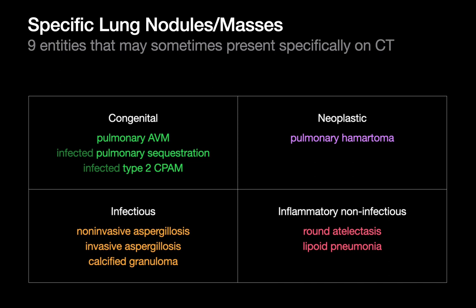So there you have it — a review of the nine entities that we need to be responsible for that can sometimes present specifically on a CT scan as a specific nodule or specific mass. These are going to be the situations where we can bypass the algorithmic workup that we usually rely on for nonspecific nodules and masses, and you can give a diagnosis now as opposed to after follow-up or after another test.